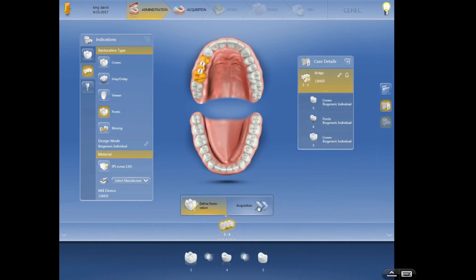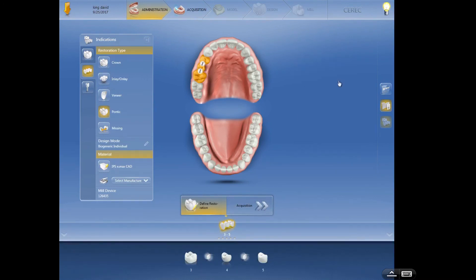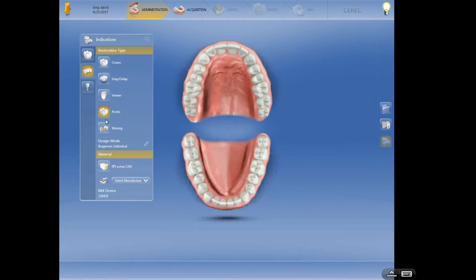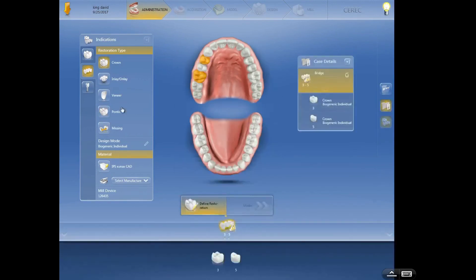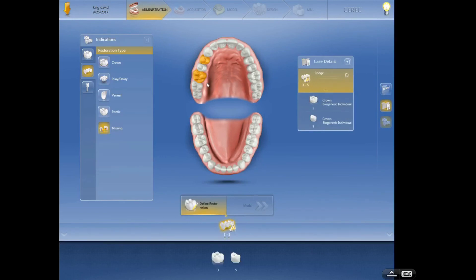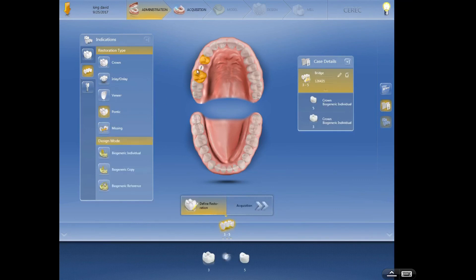Now you can see link, link, you've now got your connectors right there and the computer gives you the green arrow or the arrows active so you can move forward. Now let me show you what would happen if you were to do this. So let's do the abutments again, three and five, and if I were to say okay tooth number four is missing. Now it's missing, so how do I get a pontic on there? Now I can't select a pontic, there's no way to do that, right?